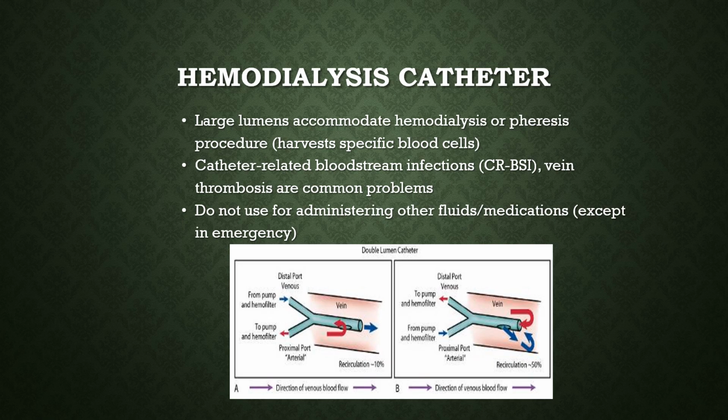So sepsis is the main complication of a central line of any type, or a hemodialysis catheter, or an implanted port. Any type of central access device, your complication is going to be sepsis and possible death. They can be very dangerous. Again, their convenience is great, but you got to make sure they need them. You don't want to put one in somebody that doesn't really need them, because the risk of bloodstream infection and sepsis is very great.